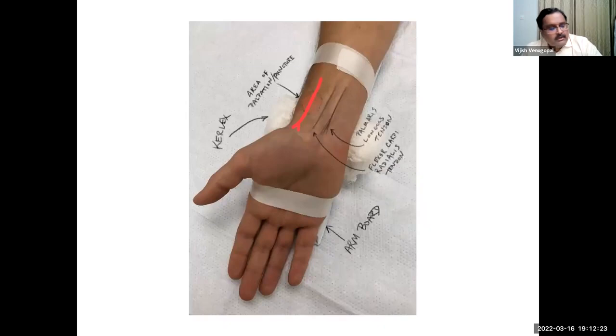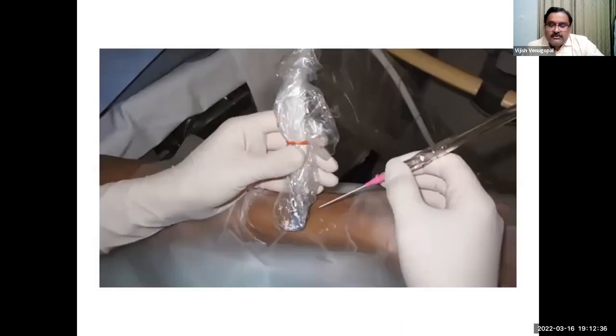And the most common arterial site that is used is the radial artery. The other arteries that can be used are the ulnar, brachial, femoral, dorsalis pedis, and the axillary artery. You can use ultrasound or you can use the palpatory method to put in an arterial line.